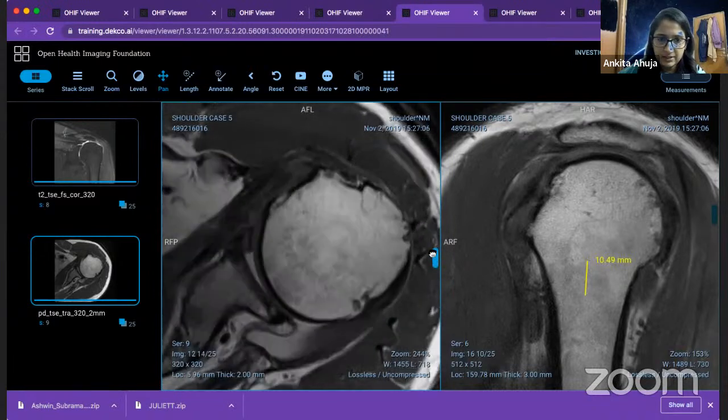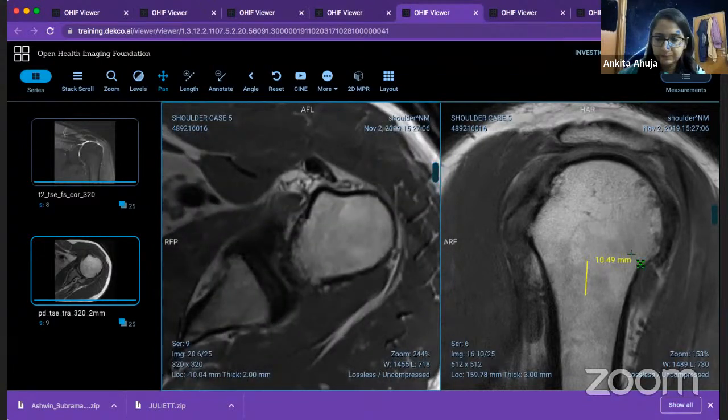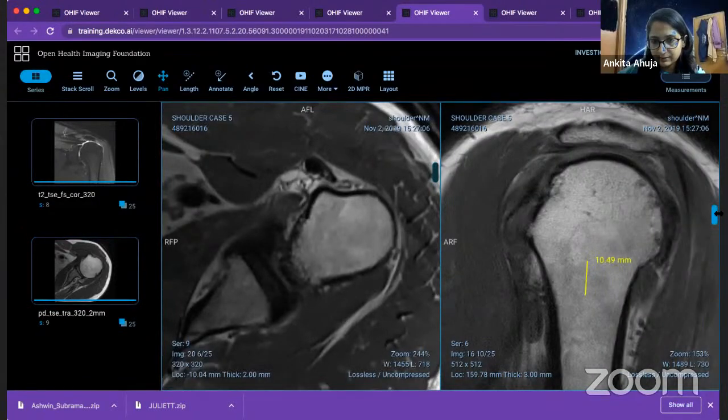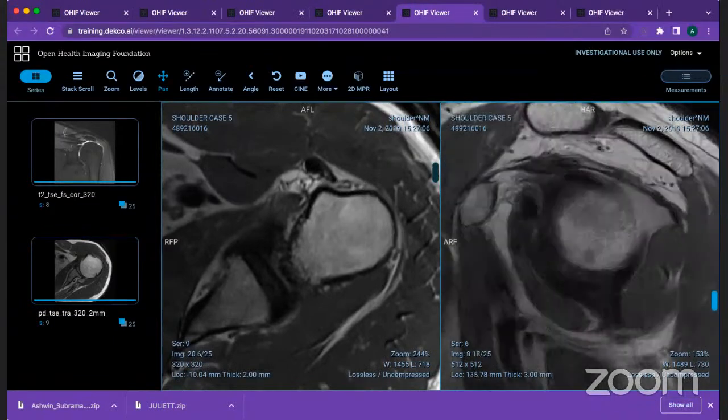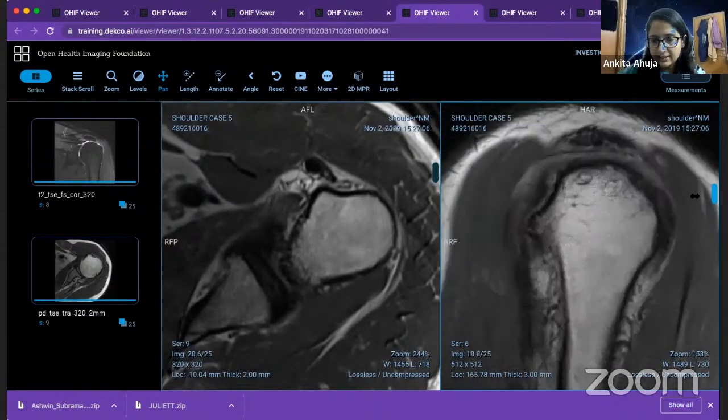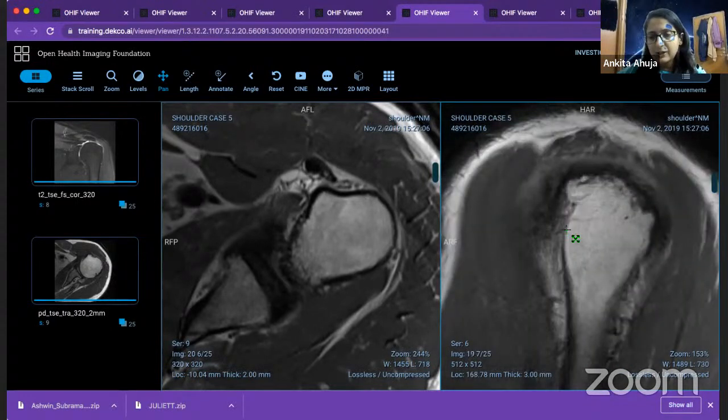It's a pretty nice case, actually. Yeah, subscapularis tear. How bad is the tear? Subscap tear with the dislocated biceps tendon. Yes, very good. So that's kind of a complete, but it's still not a full thickness subscap tear. You might need to manage it like that, although.